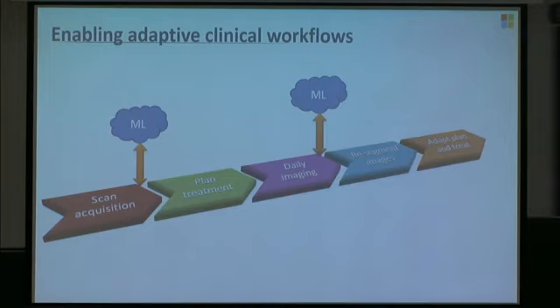Remember, our treatment devices are both imaging devices and treatment devices. So this should take about a minute, ideally, to be able to redo all of that. That's the kind of goal of what we're trying to do.